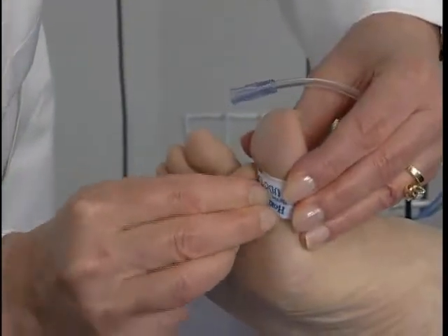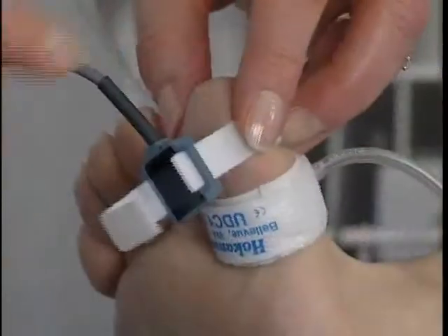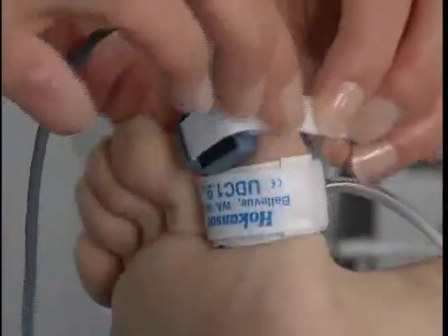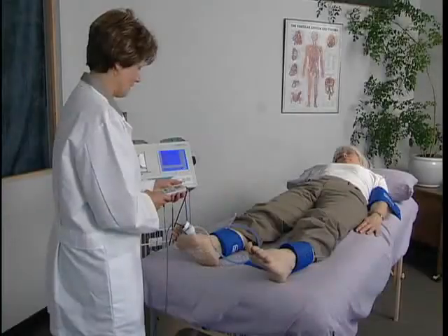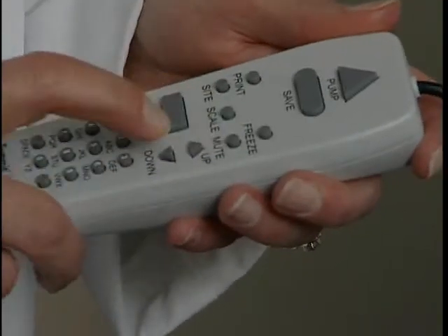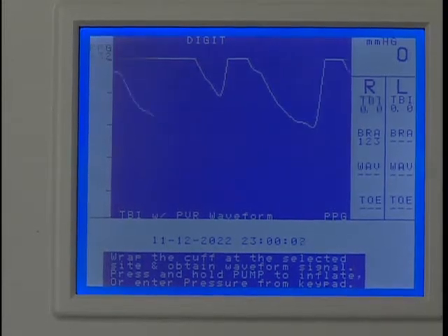Wrap the digit cuff around the base of the great toe. Move the hose from the ankle cuff to the digit cuff. Attach the PPG probe to the toe distal to the cuff with the blue side of the probe against the skin. Again, the probe should be snug but not too tight. The patient must be still. Wait several seconds for the waveform to stabilize. Press Scale one or more times as needed to adjust the vertical scaling to obtain a waveform as large as possible without clipping at the top.